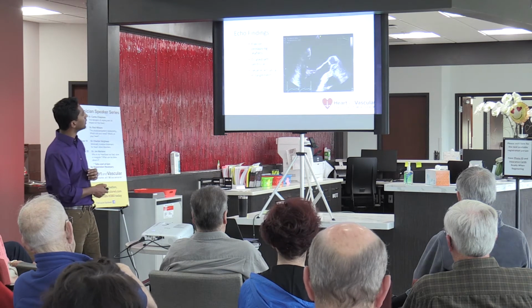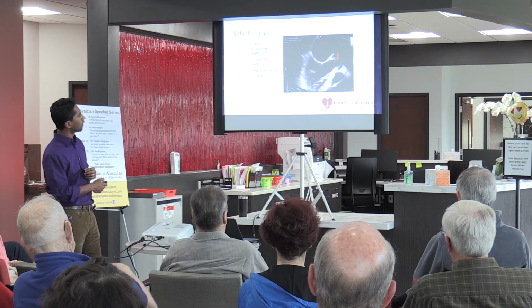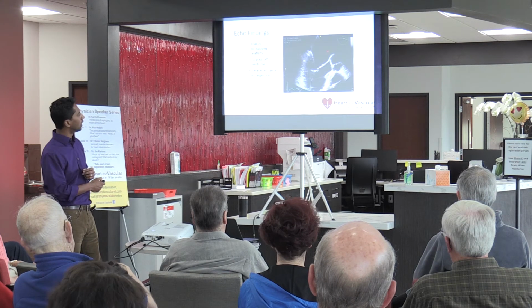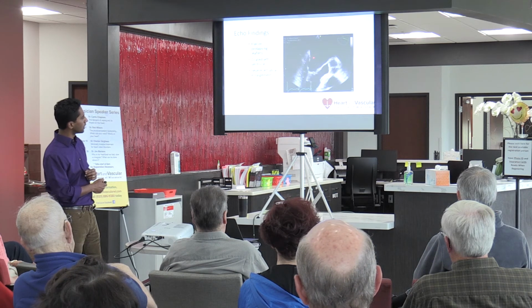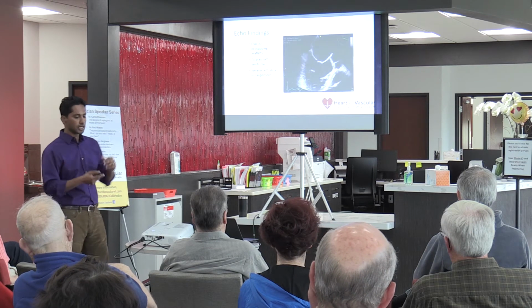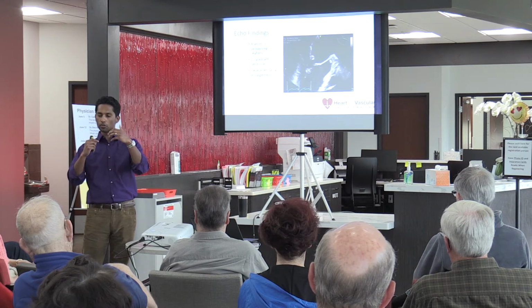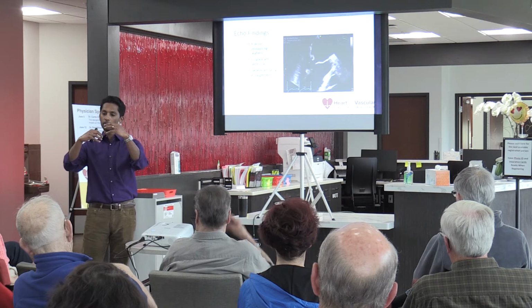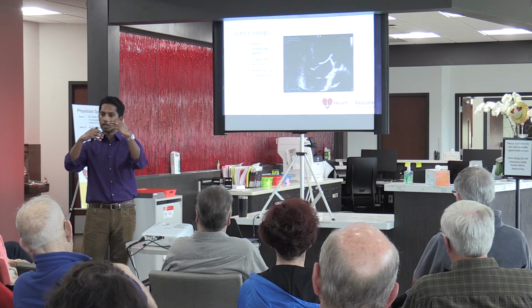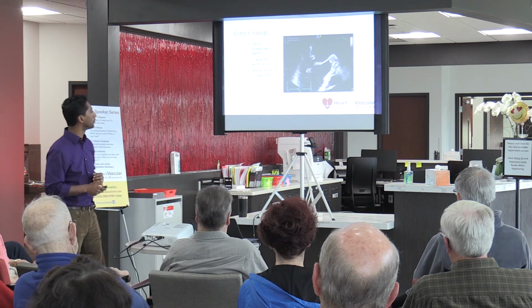So this is an example. It's a very similar view to the other view that we saw in echocardiogram by transesophageal echo, where you have the mitral valve, but clearly you can see there's something moving here that's not supposed to be moving, right? And so this structure there is a part of the leaflet that's become untethered. And so then that leaflet, instead of kind of staying where it's supposed to be, kind of flails or prolapses up, right? And so when it does that, it allows blood to leak backwards back into that top left chamber of the heart.